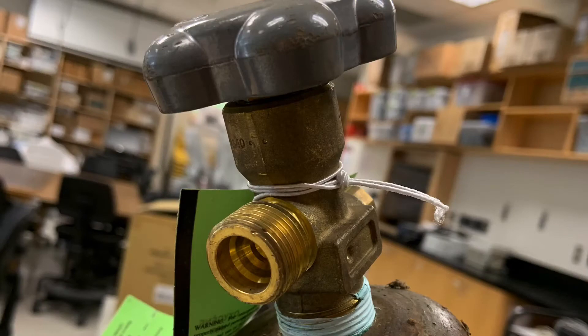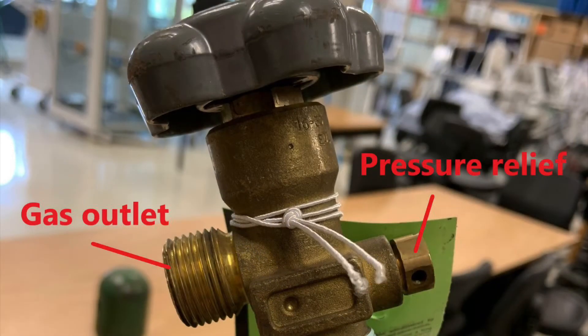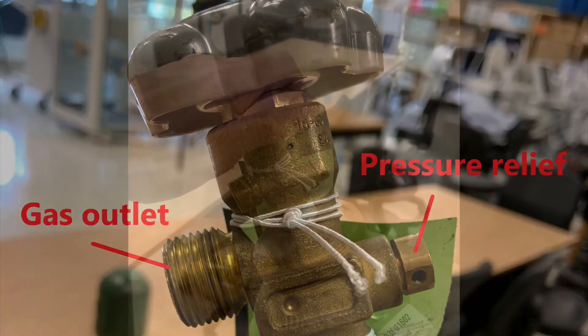Here's what a large gas cylinder looks like without the protective cap on. If you turn the handle at the very top, it will allow gas to come out of the outlet. We actually do that on purpose before we attach any connections to it, to remove any debris from the outlet of the cylinder. This is called cracking a cylinder.